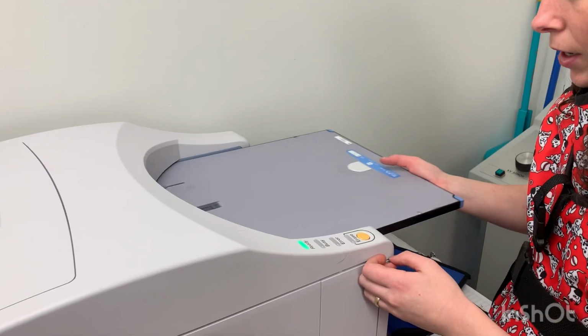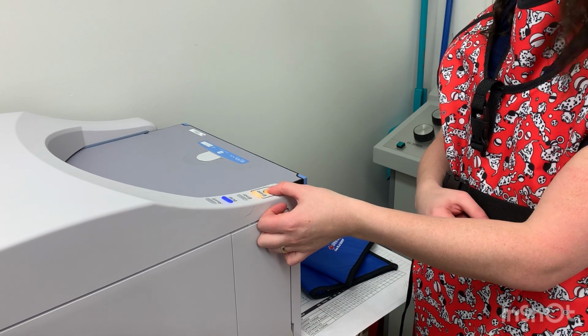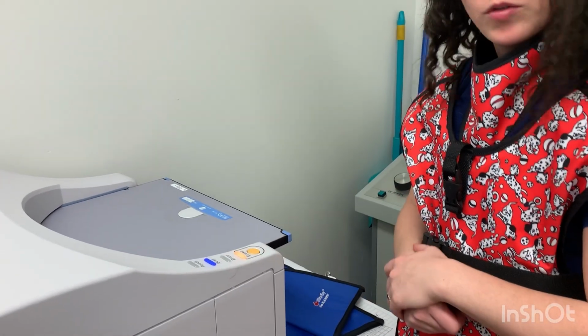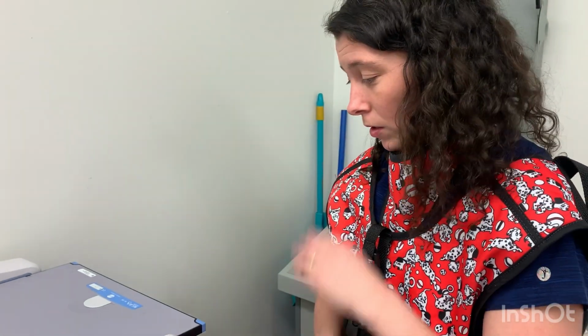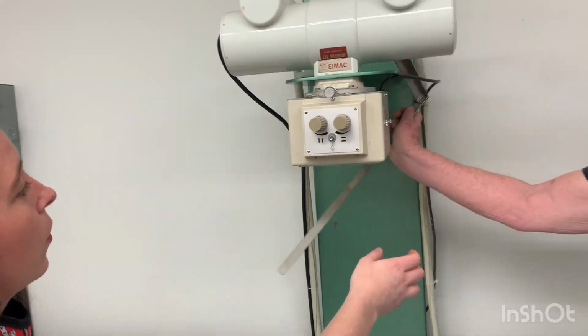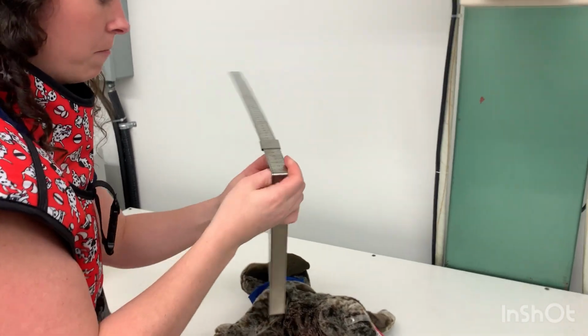So it's going to say ready here for me, and then I'm going to press it here now. You can see that it's blinking, and then it's saying that it's busy, so it's just erasing the image here now. We're just going to wait a second. While that is processing, we can measure our animal here. Alex, my assistant, to hand me the collimator, please. Thank you. Calipers. Calipers, yes, thank you.